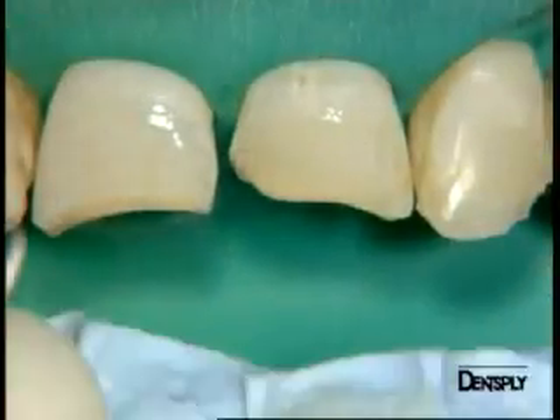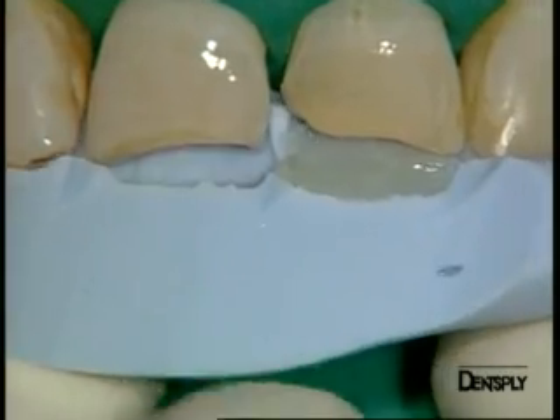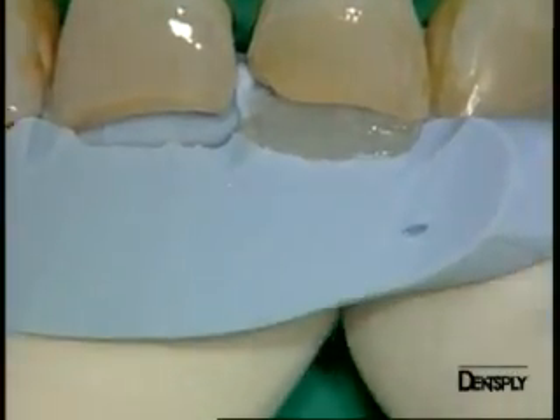We select an enamel shade which, with the aid of the silicon key, will be exclusively applied onto the palatal surface. This is also important for us.